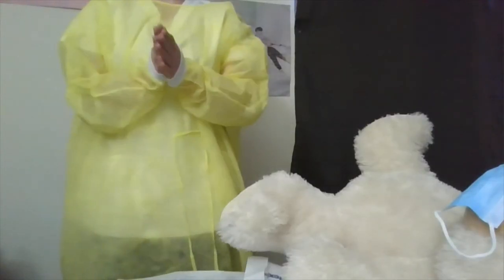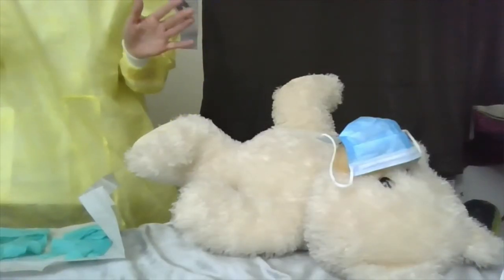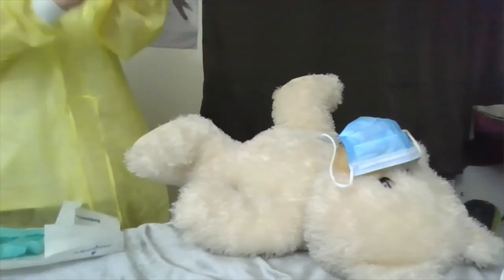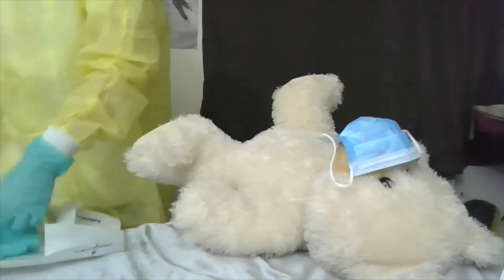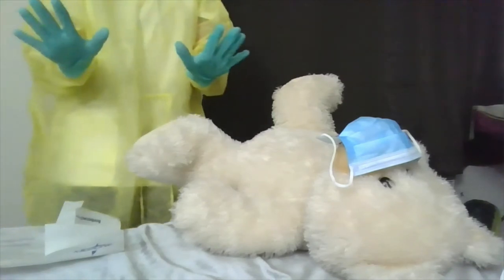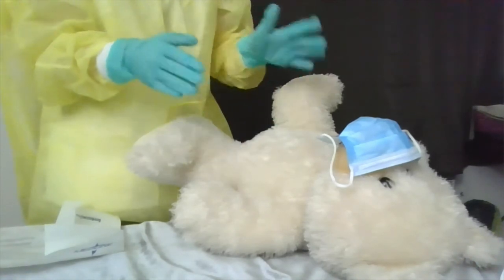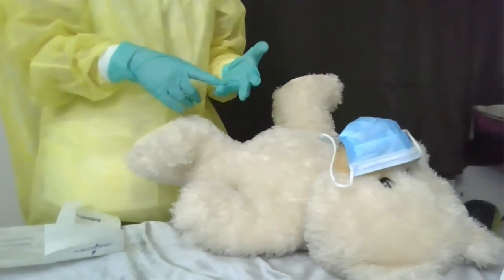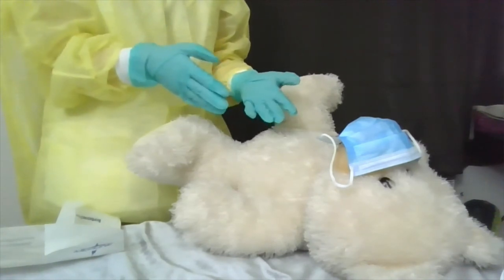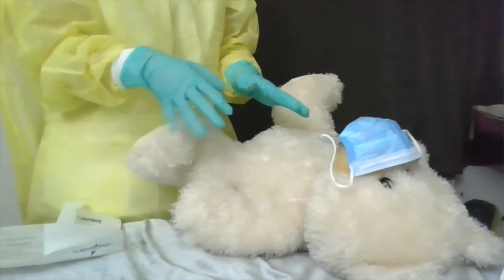I'm going to perform hand hygiene before applying my sterile gloves. Now with sterile gloves applied, I'm going to inspect the site before putting on a new dressing. I'm checking for any redness, any signs of infection, excessive warmth, discharge, or swelling. I see that there's no swelling, no signs of discharge, and no signs of any type of infection.